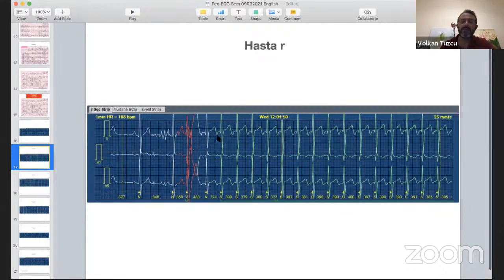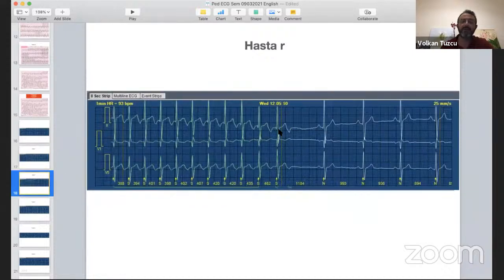And what type of tachycardia is this, right? We look at the P wave location, which is late, after the RR interval midline. So long RP SVT. So we have to say this is a long RP SVT that started with possibly a PVC. And always look at the end also. How does it end? With the P wave. Why is it important? For example, long RP SVT, what is the most common long RP SVT that we see?